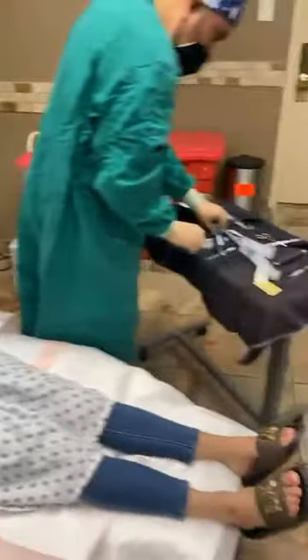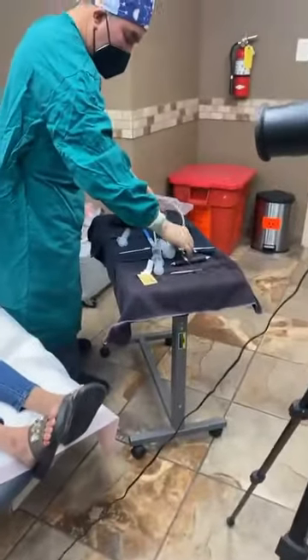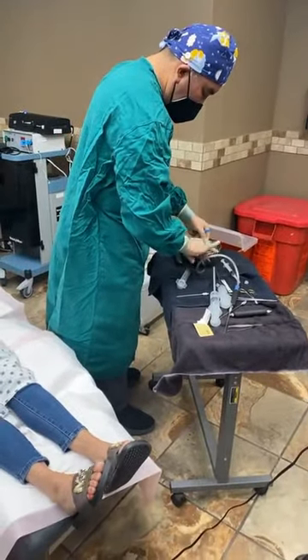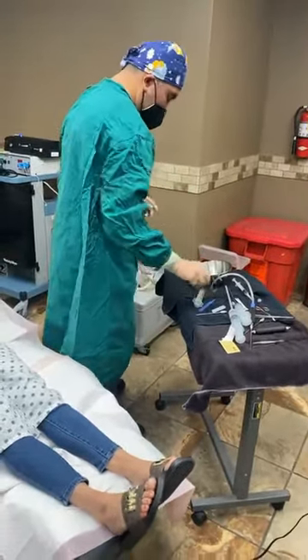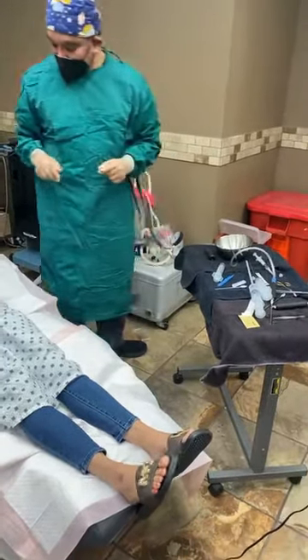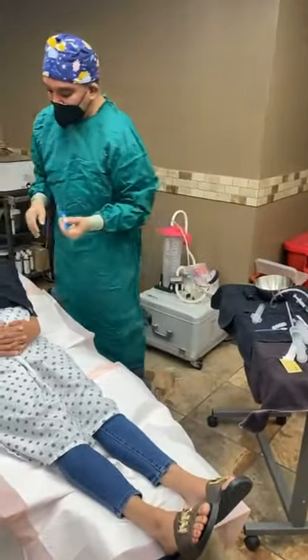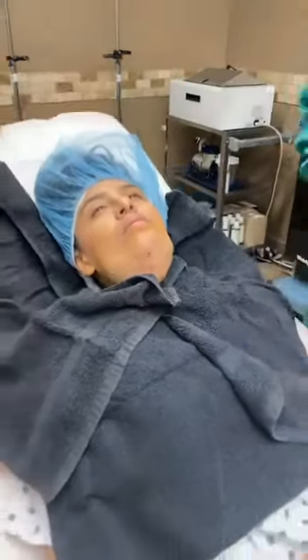All right, so next what we're going to do is make our first incision. Do me a favor, I'm going to need you to open up that. That's the incision.